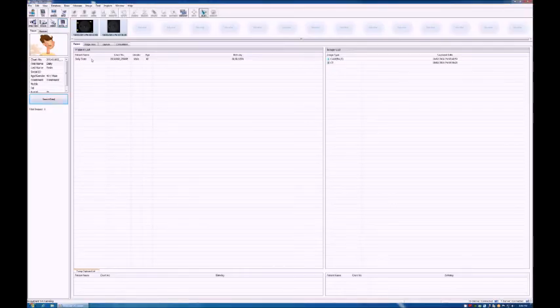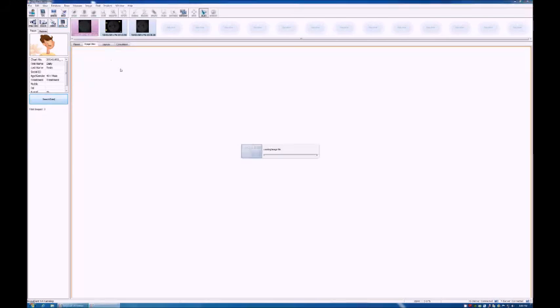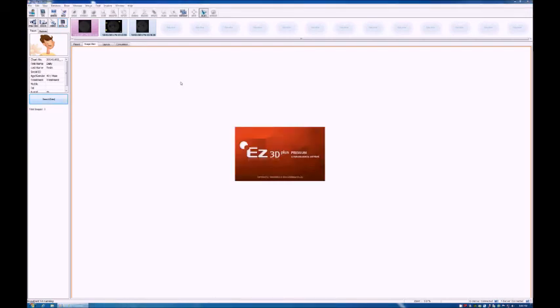All right, so we have the image saved already. We double click the thumbnail on top to open the image. And the tool we are going to use is the same, the region of interest tool, but in this case we are going to make sure that the regions of interest that we create are 25 millimeters away from the center of the image. Let me show you.